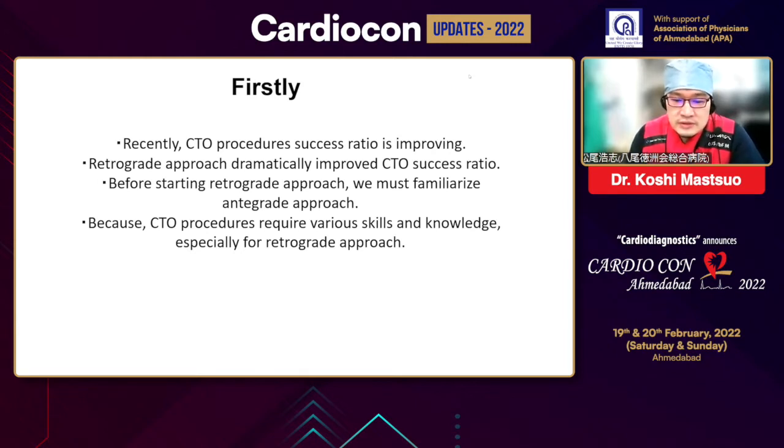Recently, the CTO procedure success ratio is improving. The retrograde approach dramatically improved the CTO success ratio. Before starting the retrograde approach, we must familiarize ourselves with the antegrade approach, because CTO procedures require various skills and knowledge, especially the retrograde approach.